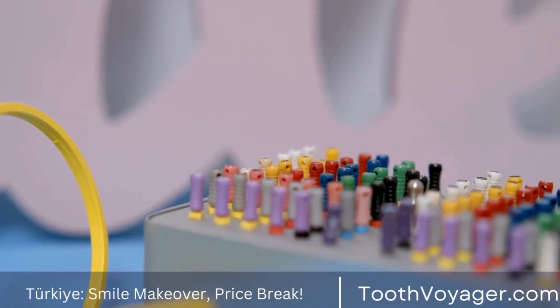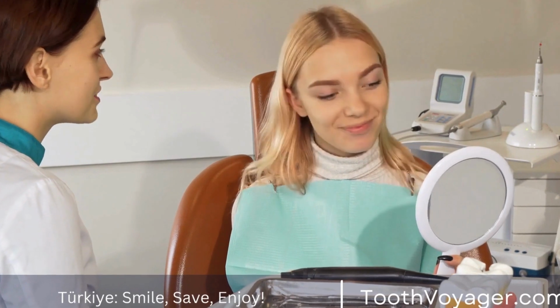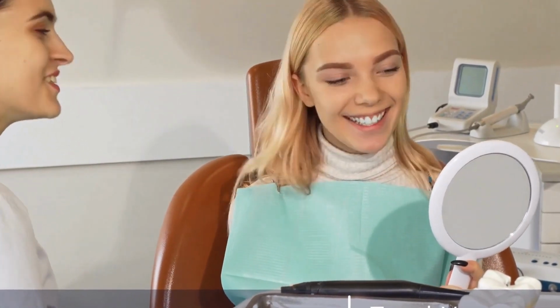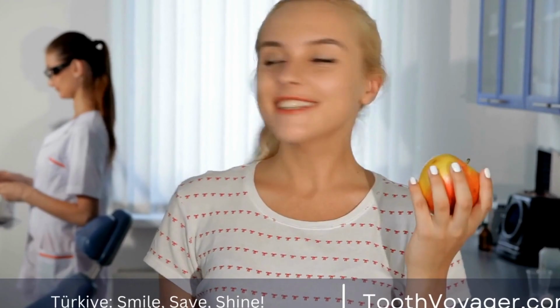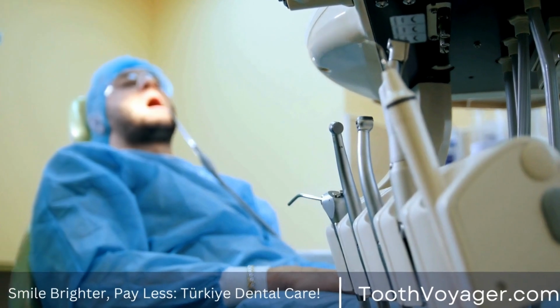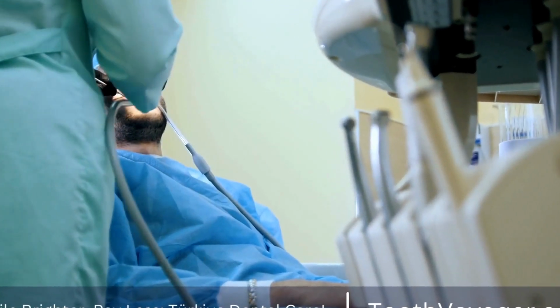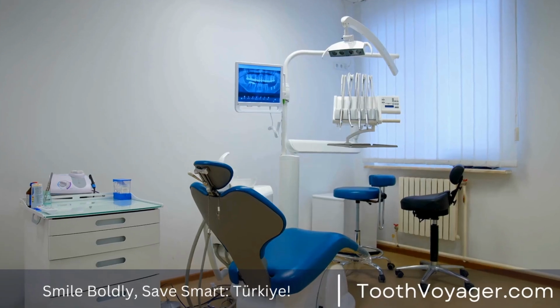5. Abutment placement. After osseointegration has occurred, the next stage in the procedure of putting in a dental implant is the placement of the abutment. This is a small connective piece which is attached to the upper part of the implant. It is used as the basis of the final restoration. The abutment is usually placed in a follow-up surgical procedure in which the gum tissue is opened so that the implant can be exposed.